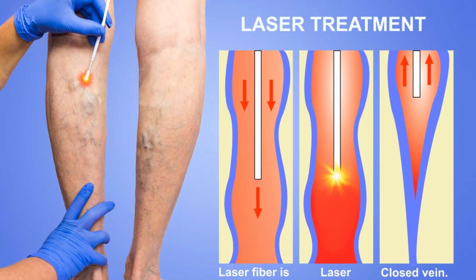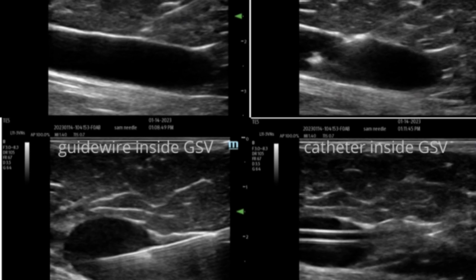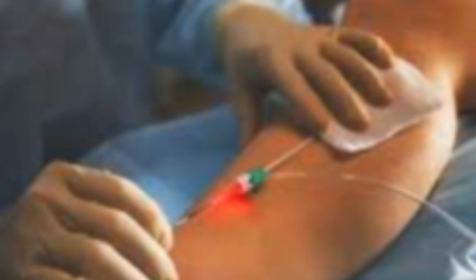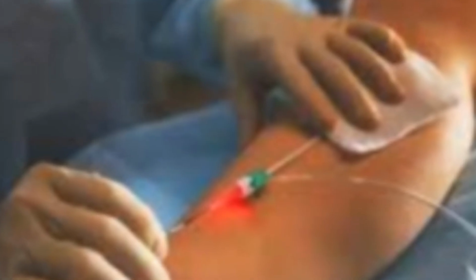So what's actually responsible for the main action? It's the blood that's left inside the vein, the intraluminal blood surrounding the fiber tip. This blood absorbs the laser energy and heats up to coagulation temperatures, no matter which chromophore, hemoglobin or water, is the primary target. Here's where it gets interesting. The dominant factor in vein closure isn't how much light the wall absorbs, but how heat transfers from the hot layer of blood coating the fiber tip through to the vein wall.